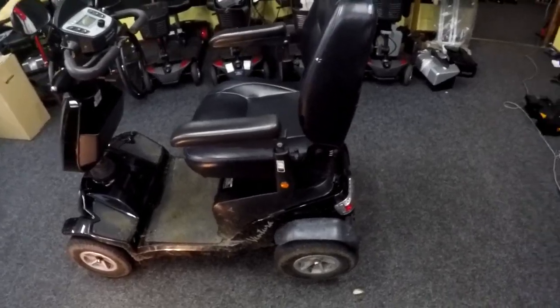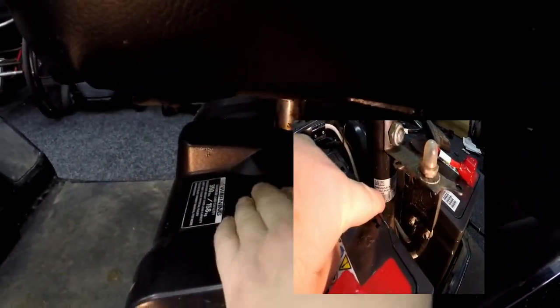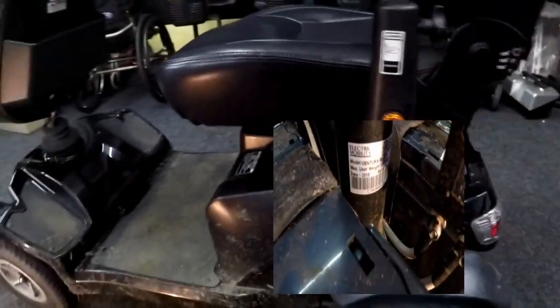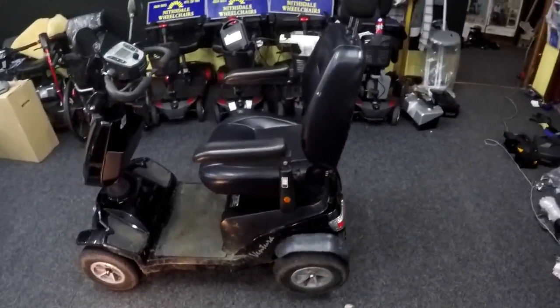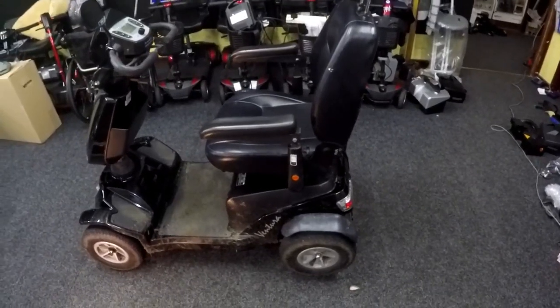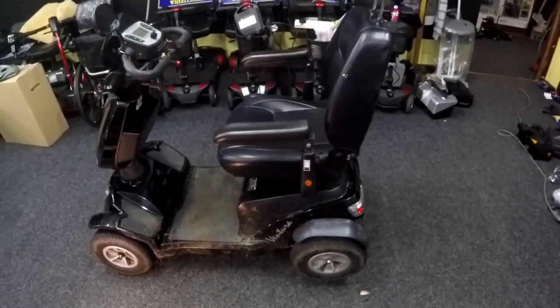Now the reason why I know it's 4 years old is because the serial number is stamped on the shaft in there, so you've got to take the seat off and the cover off to get to the serial number, and that will tell you how old the scooter is. Usually serial numbers are on the seat post so everybody can have a wee look, but not on the seat, the seat post that's on the frame.